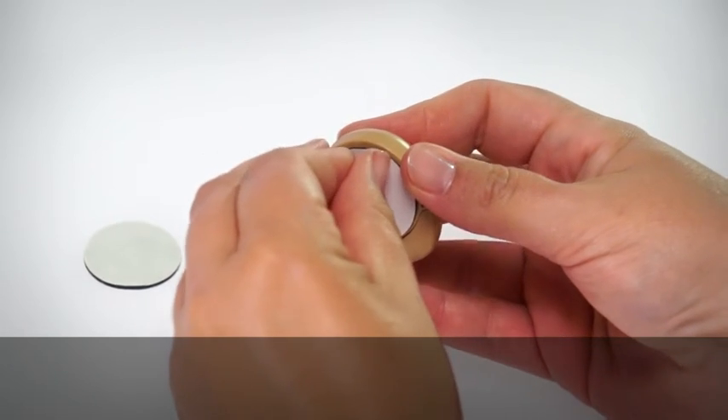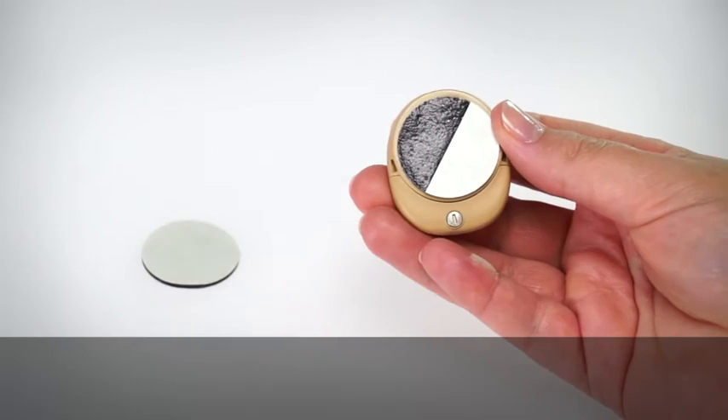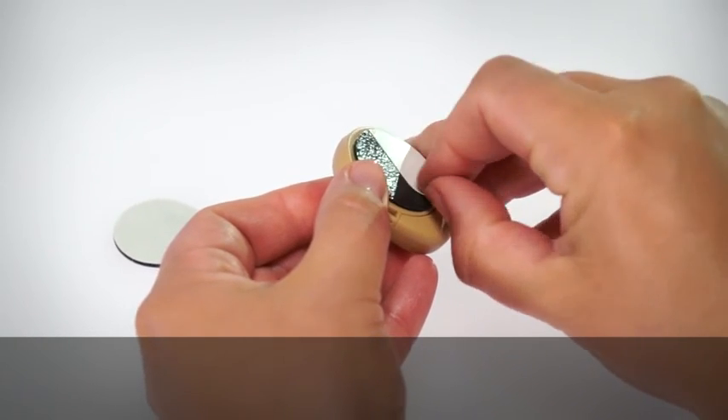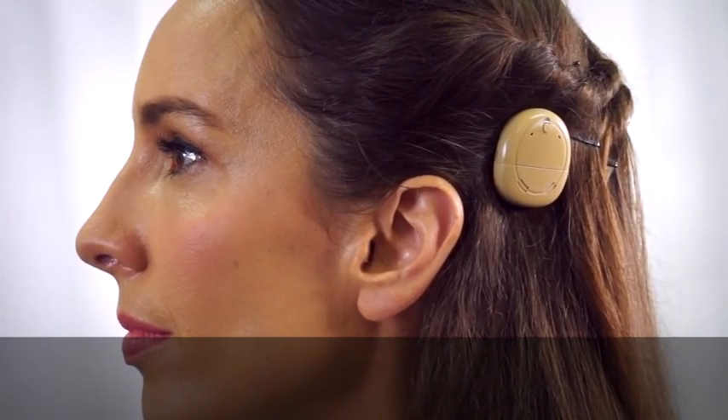Peel off the two semi-circular backing covers on the cushion side of the pad. Wear your Kanso as usual. You may need to change to a stronger magnet after attaching a SoftWear pad.